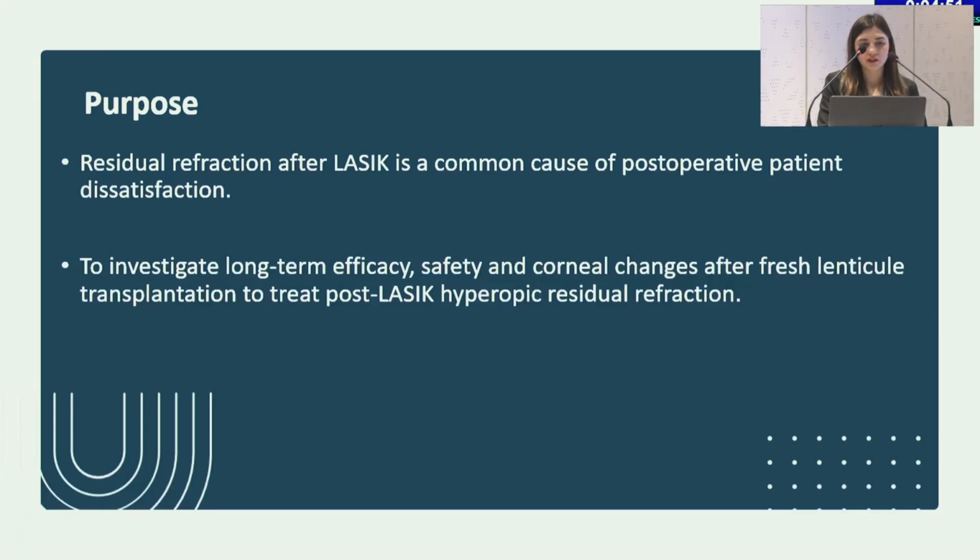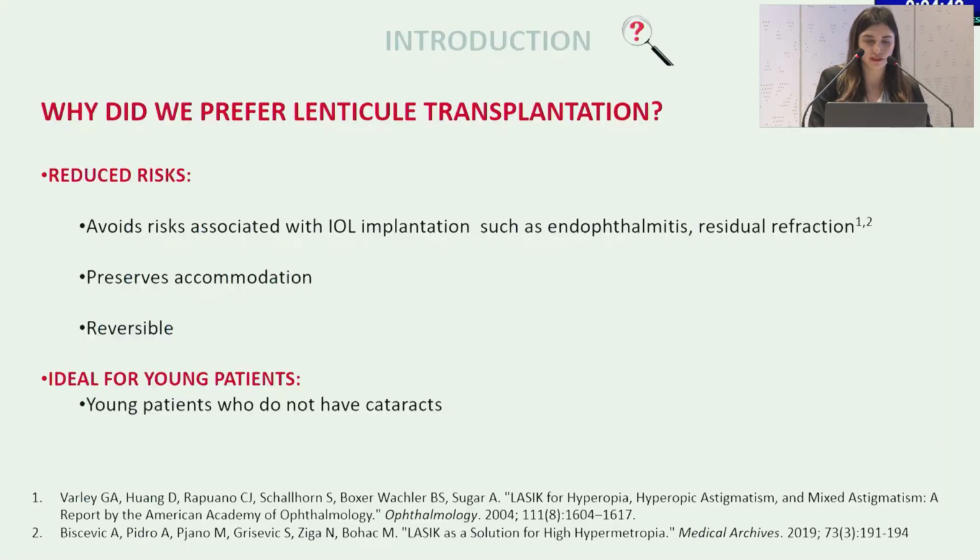In our study, our purpose was to investigate long-term efficacy, safety, and corneal changes after fresh lenticule transplantation to treat post-LASIK hyperopic residual refraction. So why did we prefer this procedure? Because it preserves accommodation and it's reversible. The lenticule can always be explanted when needed. And also it's ideal for patients who do not have cataracts.